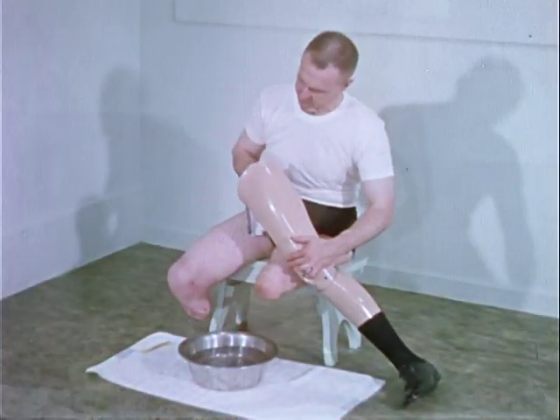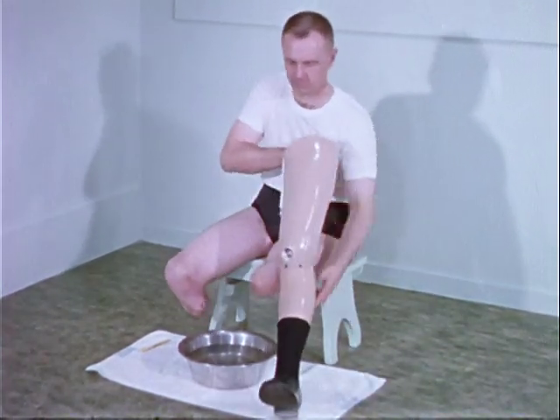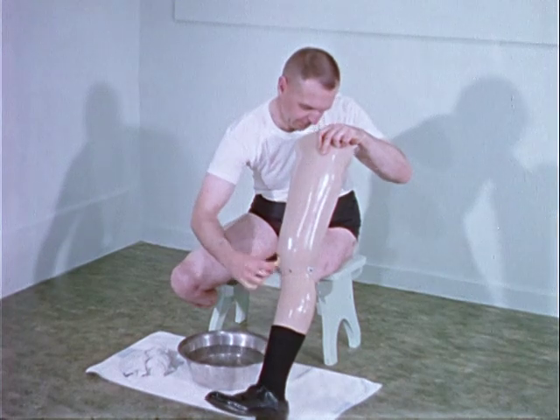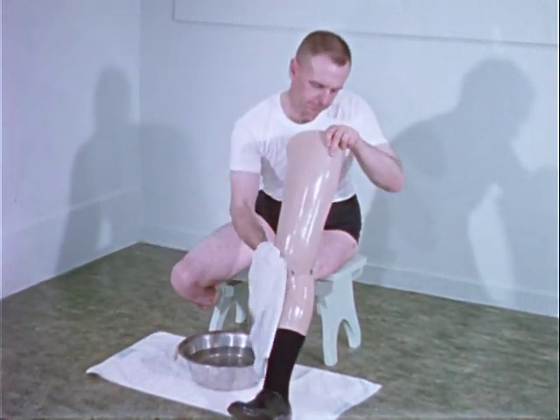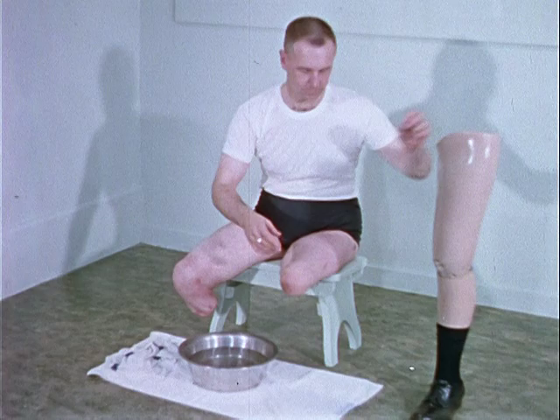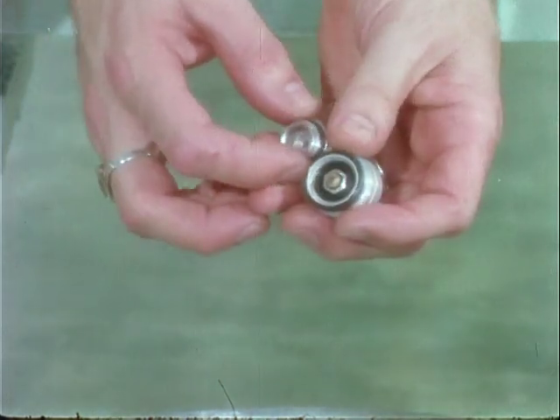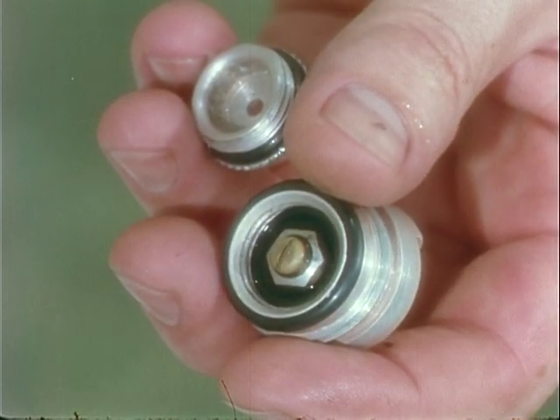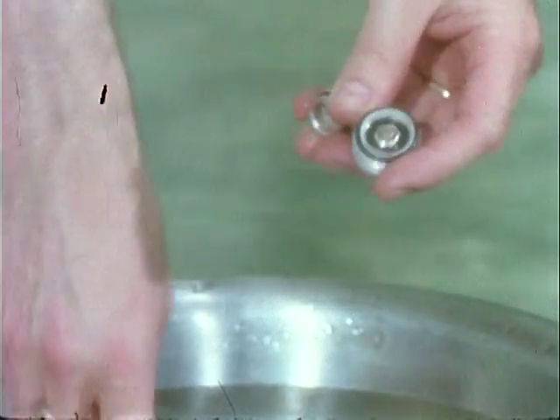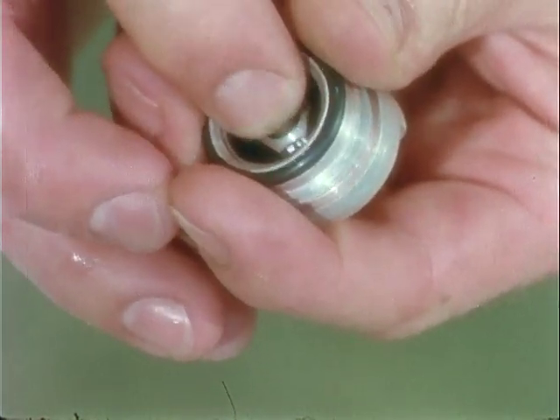Since the socket of the artificial limb may itself produce a skin disorder, cleansing of the socket is as important as care of the stump. Cleaning the valve seat will help prevent air leakage. Dirt or powder in the valve will result in a poorly maintained vacuum. Depressing the spring allows for thorough cleansing of the valve and rubber gasket.